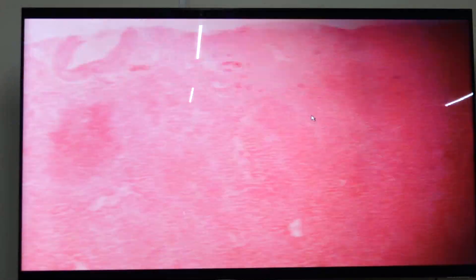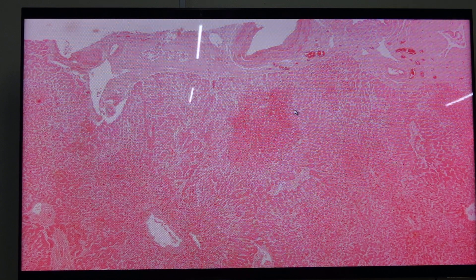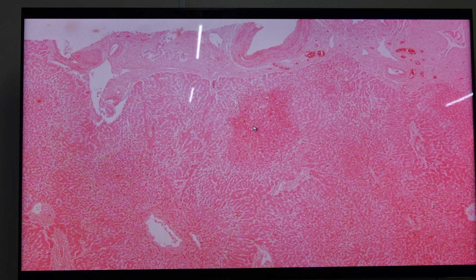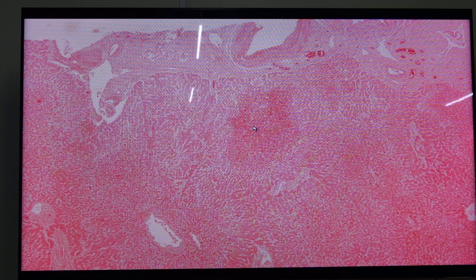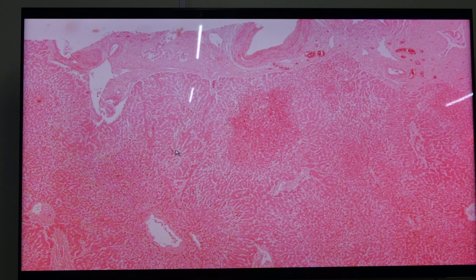Looking at the scanning view, you can see patchy areas showing lighter and darker regions. Grossly, this is what we call the nutmeg liver, which is seen in chronic passive congestion of the liver, with lighter brown color and red to darker brown color.